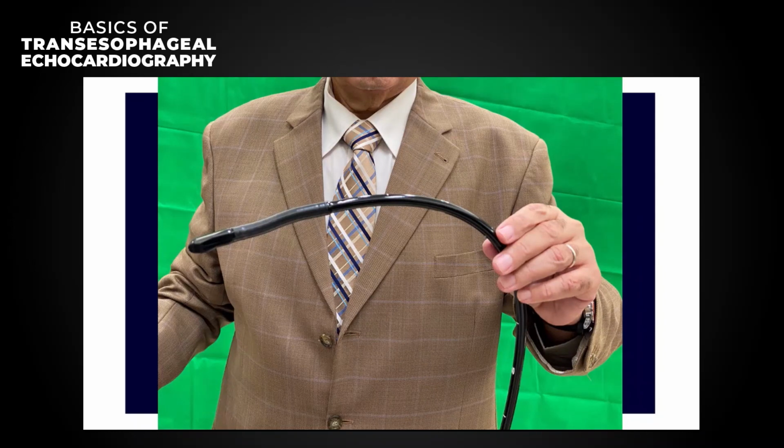For the right pulmonary veins, we do in the mid-esophageal level at 0 degree a clockwise rotation to the right and put color flow, and you will get the jets of the right pulmonary veins. Okay.